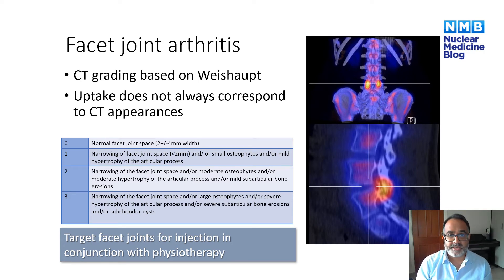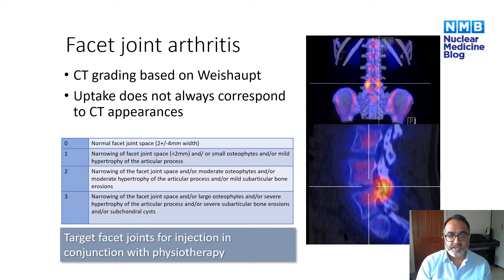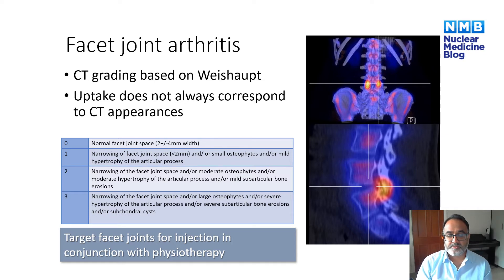If we decide to use SPECT CT to identify facet joint arthritis and target the facet joints, we could rely on a CT-based grading system. There are four different grades: grade zero with normal facet joint space; grade one with narrowing and small osteophytes; grade two with further narrowing, moderate osteophytes, hypertrophy, and subarticular erosions; and grade three with severe subarticular erosions, subchondral cysts and large osteophytes. However, the uptake does not always correspond to the CT appearances, so we must look at the SPECT over and above the CT when targeting facet joints.